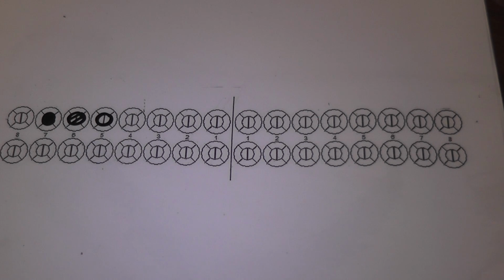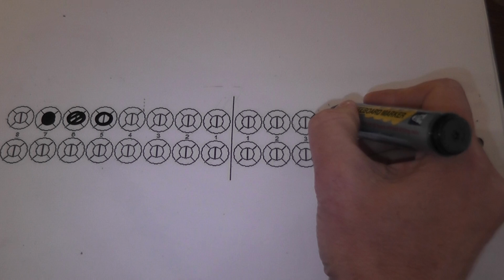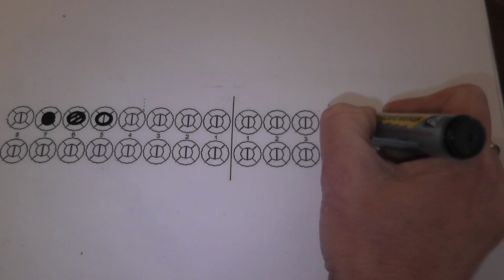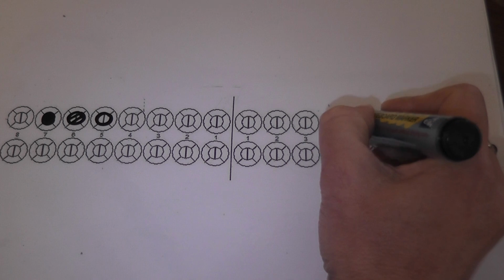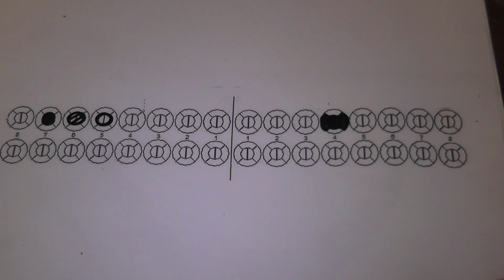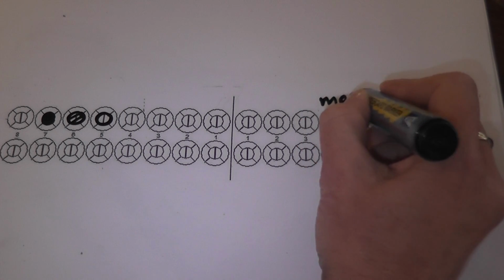A filling can be a big or small size and may spread across multiple surfaces. Here is an example. The 24 has a satisfactory mesial occlusal distal. You can see that I have coloured all 3 surfaces. This type of filling is often called an MOD for short.